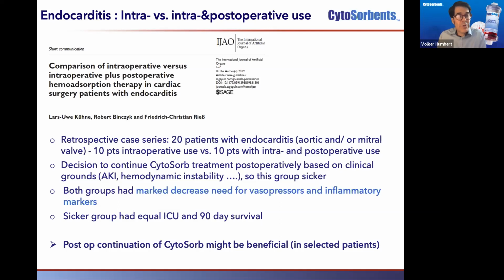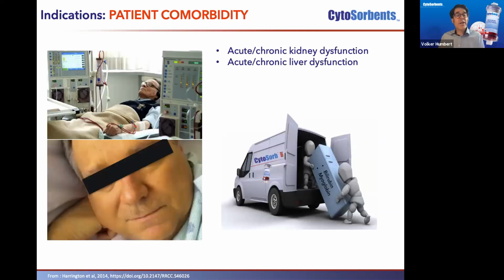However, one should not forget that in one or the other patient, it might also be advisable to continue the therapy postoperatively. One last word on a potential trigger for indicating Cytosorb therapy intraoperatively. However, this has not been very well investigated so far, and this is patient comorbidity. As I said, it can either be the surgery or it can be the patient.